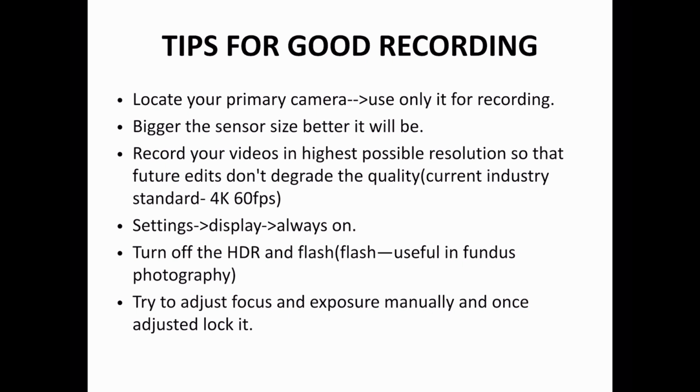You need to record your videos in the highest possible resolution so that future editing doesn't degrade your quality. And the current industry standard right now is the 4K 60 frames per second.